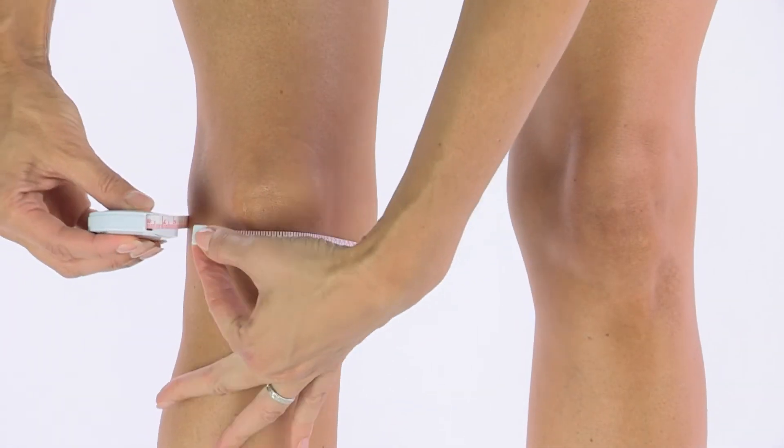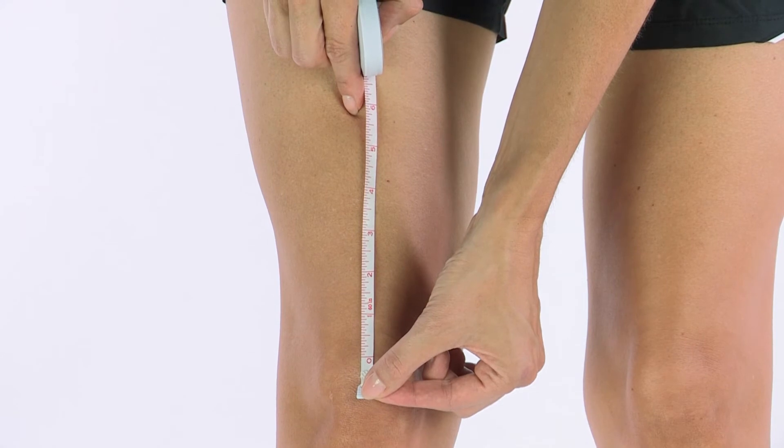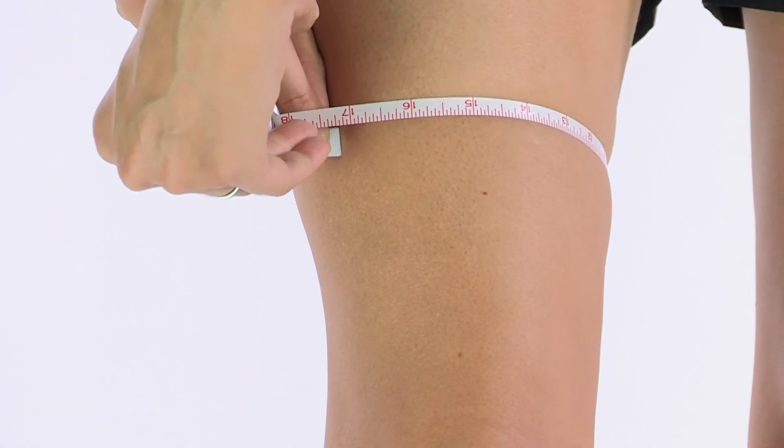First, measure the circumference of your leg at the midpoint of your kneecap. Next, measure six inches up from the center of your kneecap. At the six-inch spot, measure the circumference of your thigh.